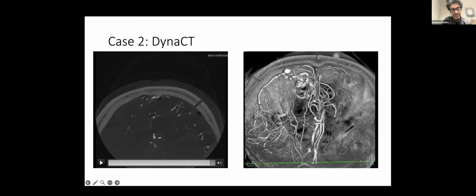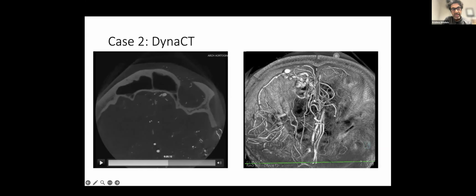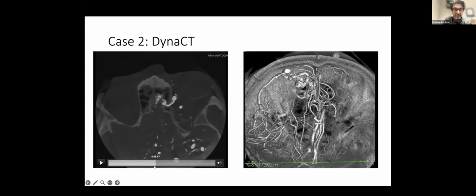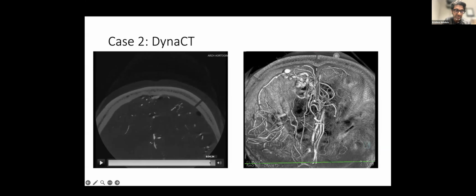that we like to do these cases is actually getting 2 microcatheters down into this venous outflow, again, to the level of the fistula itself. And 2 microcatheters we typically try to put at the venous head. 1 microcatheter will try to coil until we get kicked out, and then you're left with this second microcatheter that you can Onyx behind it. And a lot of times in these situations, this tends to be the most difficult, or one of the most difficult parts of these cases.